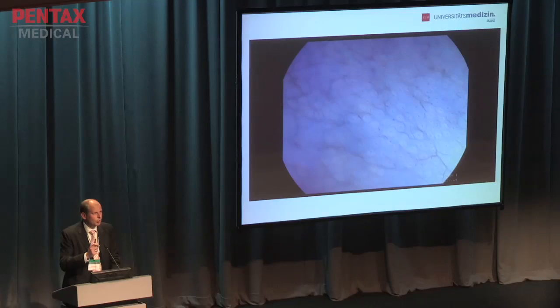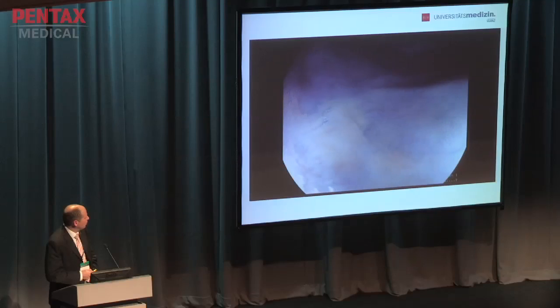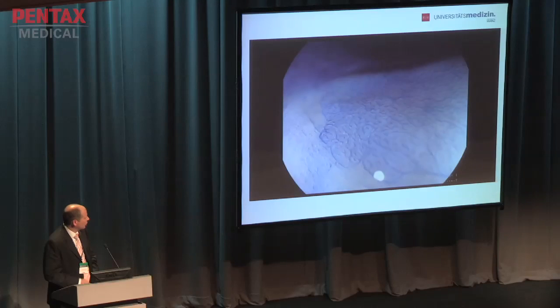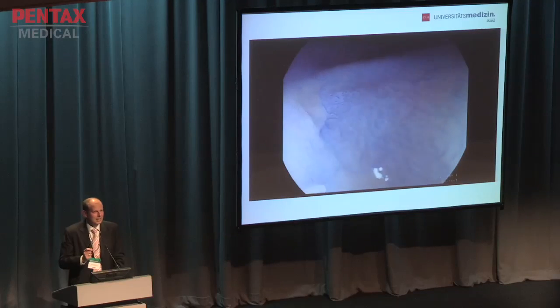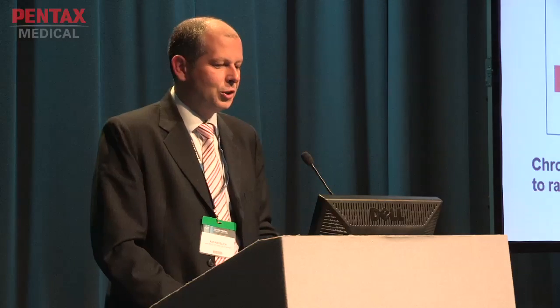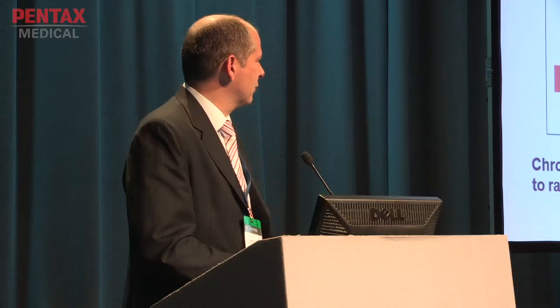But it's even more important not to look at the mucosal architecture, but more to identify lesions. And that's a type 2B lesion, completely flat, you see here. It's not elevated, but now the border is seen after chroma endoscopy. It does not mean that if you do a targeted biopsy on the lesion, you always will find dysplasia, but your probability to find dysplasia is 5 times higher than without any lesion. And there's a proven value of chroma endoscopy in patients with ulcerative colitis.